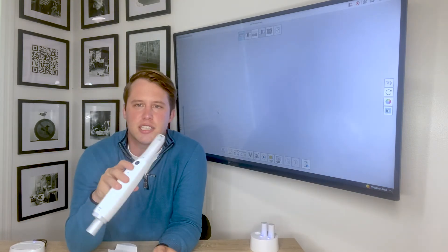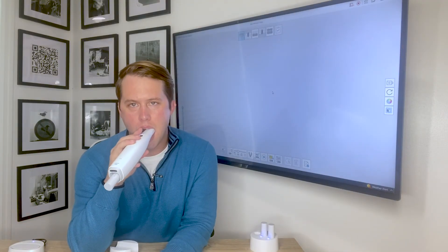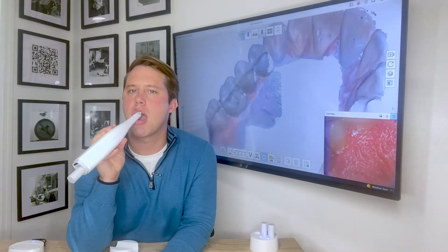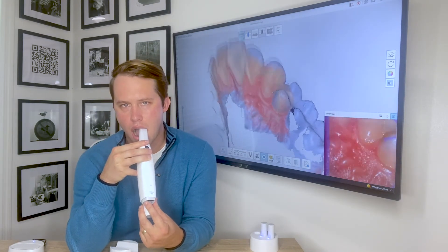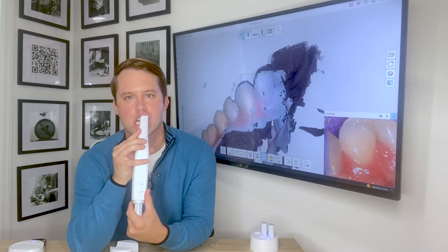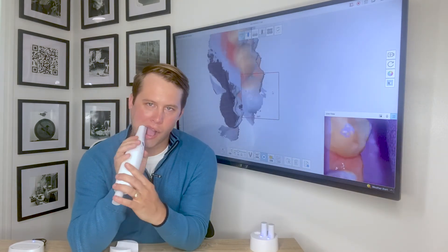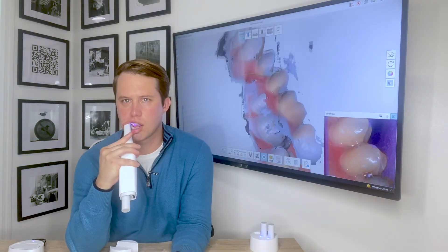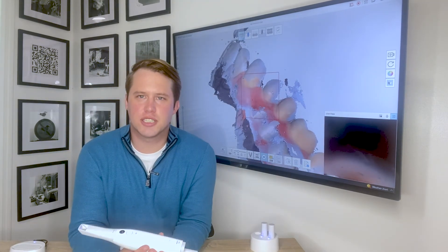So for the first time, scanning with the i700 wireless scanner — let's see how this goes. [Live scan demonstration.] Extremely fast full arch scanning capability.